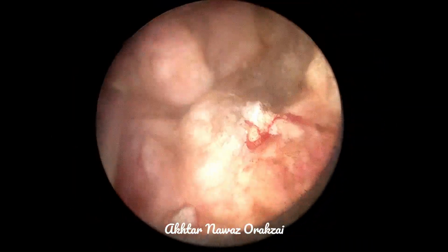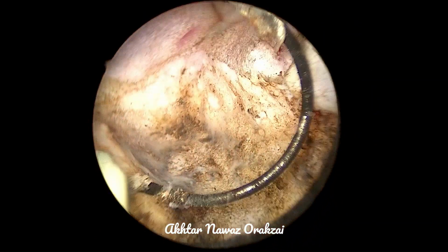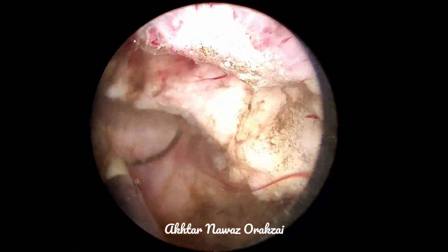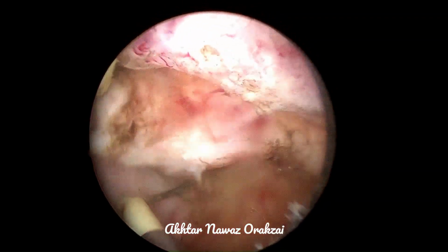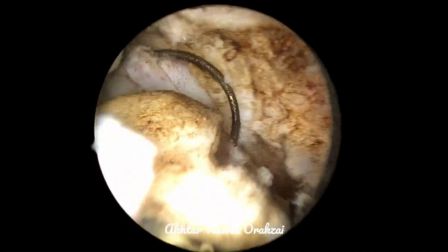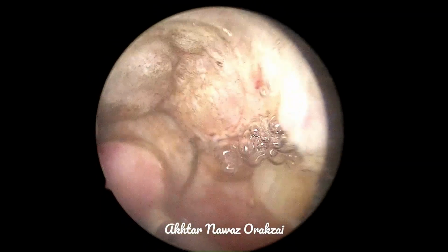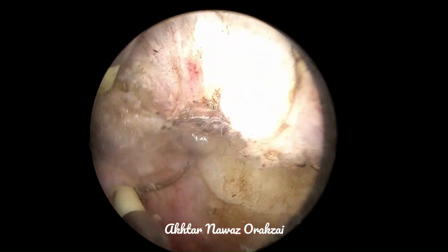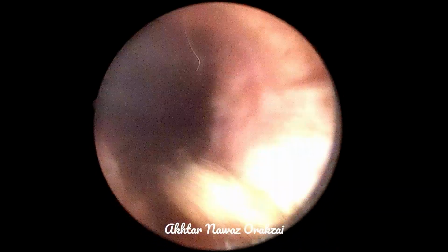Because the arterial blood supply usually runs in the space between the adenoma and the true capsule. So seeing those brisk vessels, arterial bleeders, should also make the surgeon alert about the nearness to the capsule.